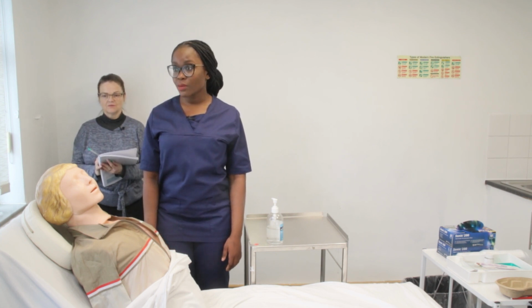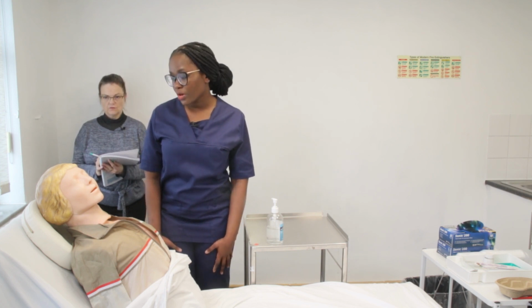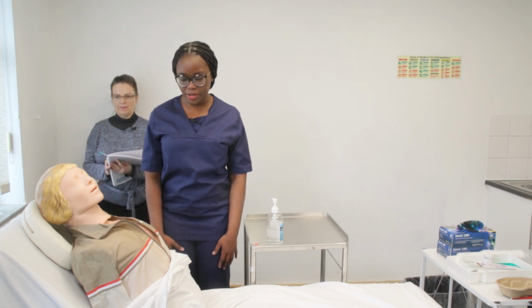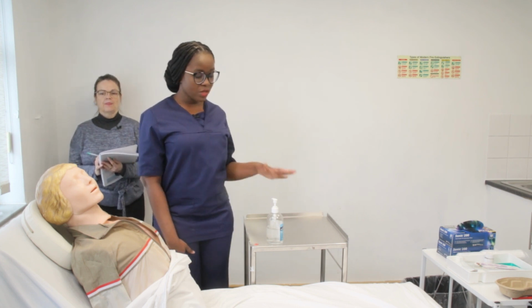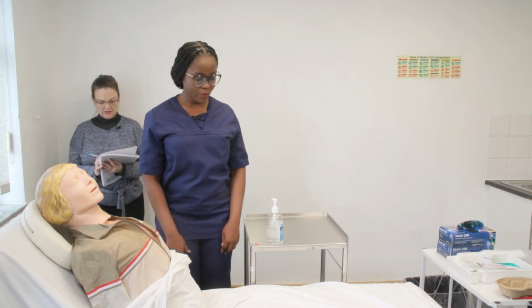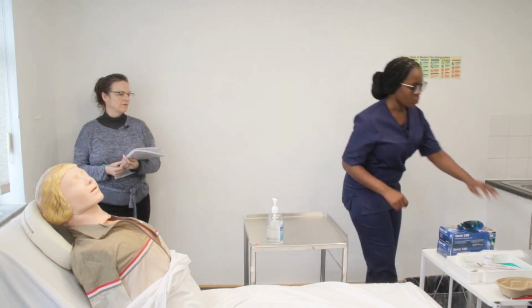Yes. All right, I'm just going to provide privacy. And do you mind sitting upright for me in a semi-upright position? Yes. Pillows behind your head. Okay, I'm just going to leave you now and get the items ready and I'll come back to you. Is that okay? Okay. Leaving Sue, gel my hands, wear my apron.